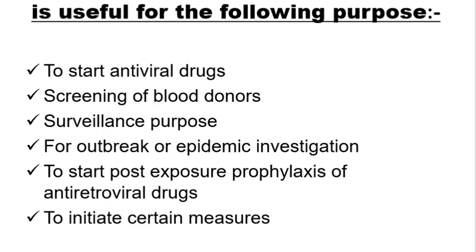diagnosis. So, common types of samples for the diagnosis of viral infection involve nasopharyngeal swab, blood, body fluids like cerebrospinal fluid, urine or stool samples, scrapings, biopsy samples, etc. So after the collection of sample, it has to be put in suitable transport media and sent to the laboratory as soon as possible with proper temperature condition. So now what is the importance of diagnosis of viral infection?